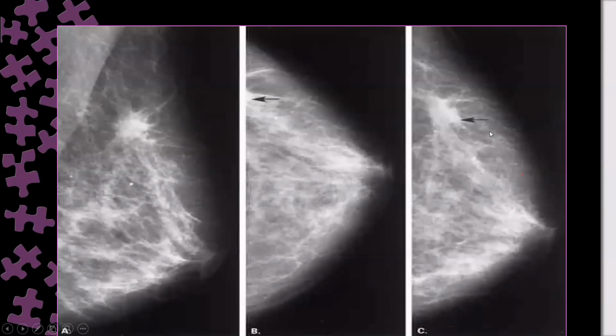So I will go for the extended lateral, because there I will go more toward the lateral, pulling the whole breast laterally. I ignore the medial portions. I pull to the end of the posterior lateral breast and concentrate on the lateral. So I could see even the posterior portion of the breast on the extended lateral. So this is an exaggerated lateral CC view.